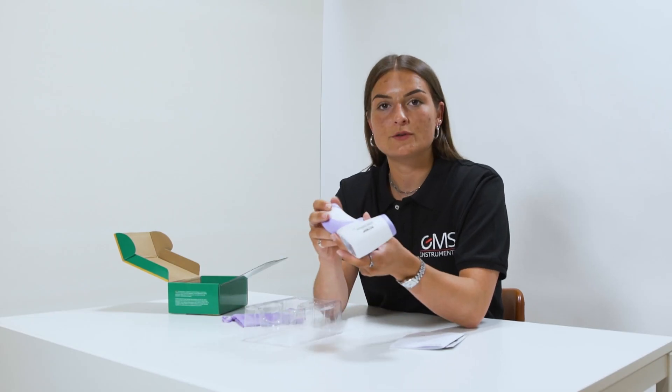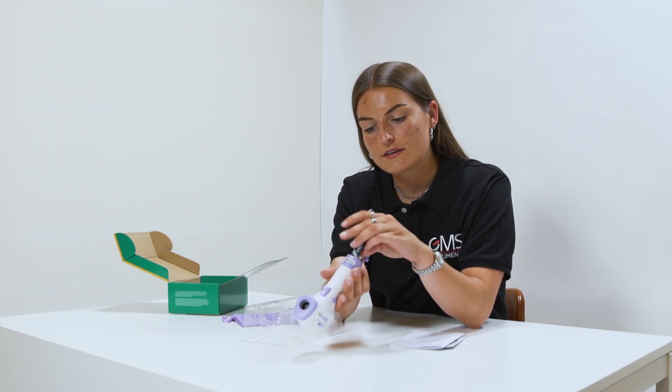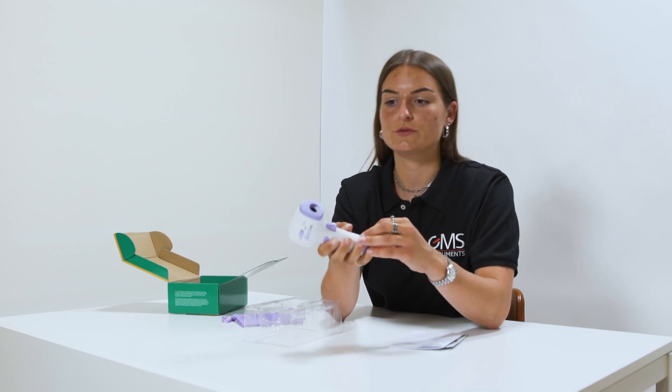Before being able to use this forehead thermometer, you have to put in the batteries. Just like that. And you're good to go.